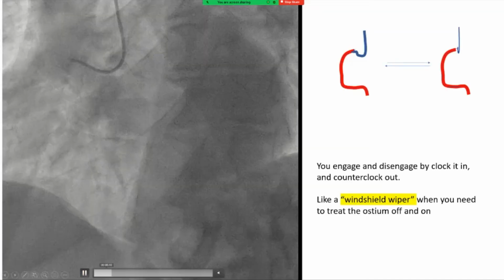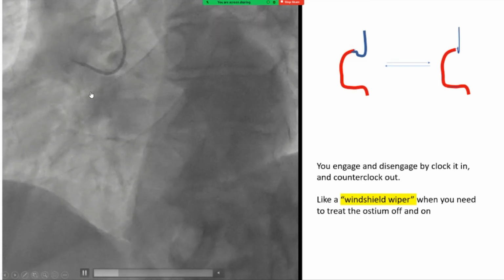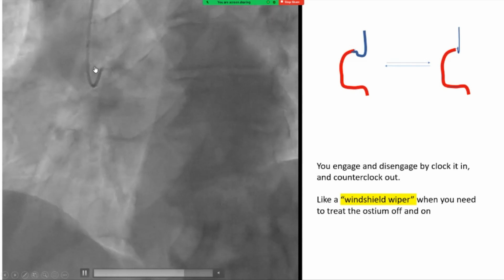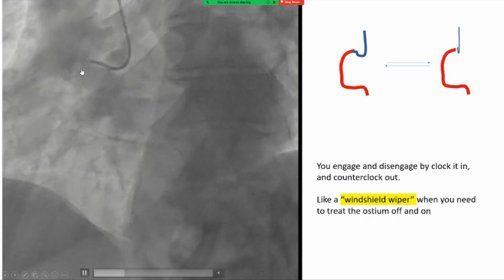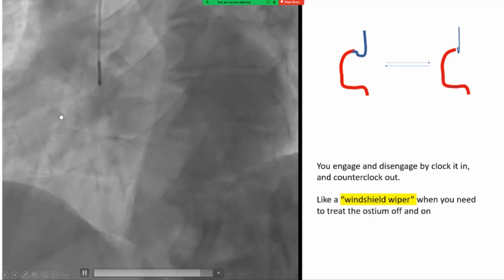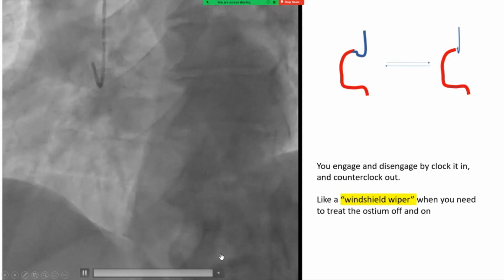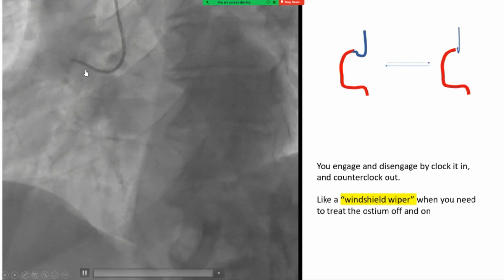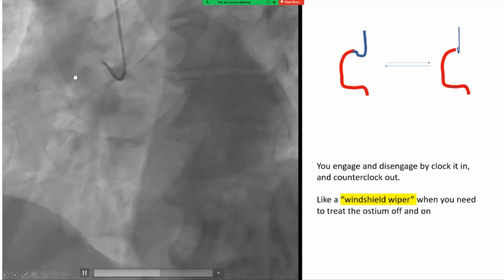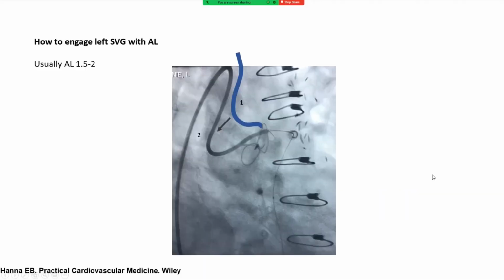This is another case here where we were maneuvering the Amplatz left in a windshield wiper manner. We will counterclock to disengage and clock to engage as needed when we need to advance our devices or when we need to pull out our devices. Also as needed for ostial stent positioning. I will move on now to explain how to engage left vein graft with Amplatz Left.